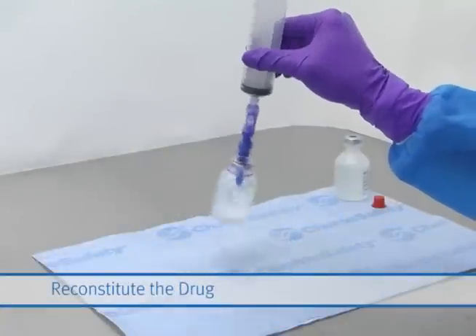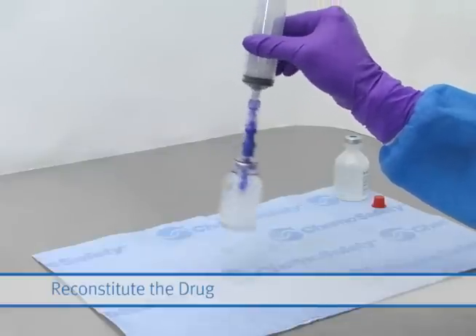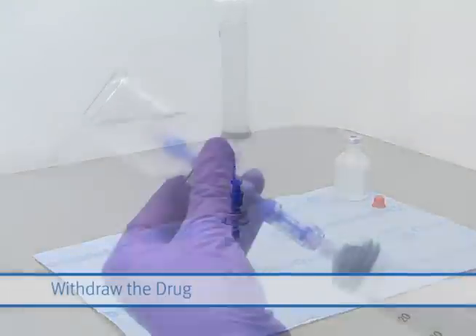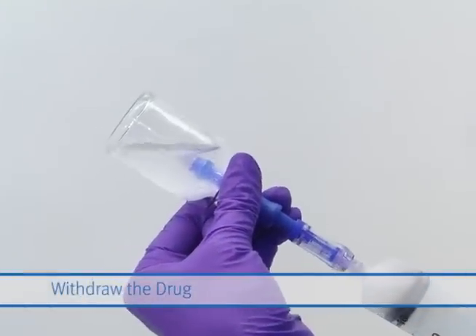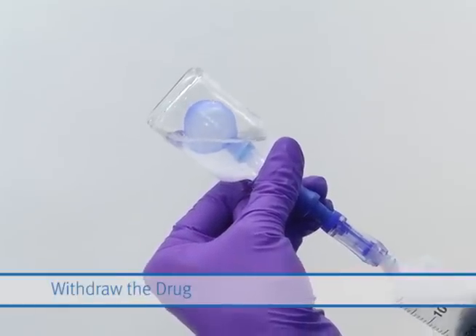Reconstitute the drug. Aspirate the drug from the vial. The Genie balloon will automatically inflate when the pressure in the vial requires it to.